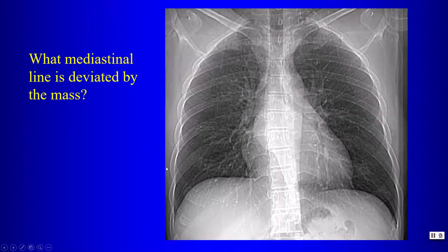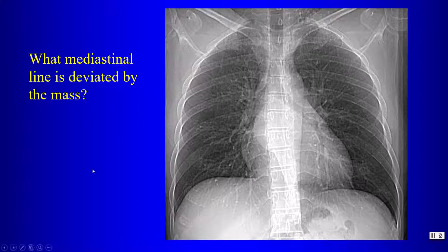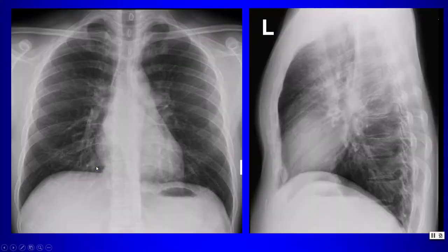Starting with a case: what mediastinal line is deviated by this mass? On the left side we have the left paraspinal line, here is the descending thoracic aorta, and this line that is deviated is the azigoesophageal line. We have a subcarinal lesion producing deviation of the azigoesophageal line, which in our radiologic scheme indicates a middle mediastinal mass.